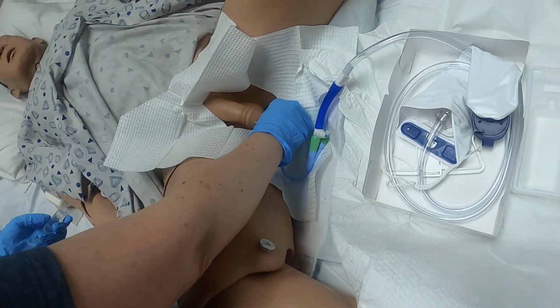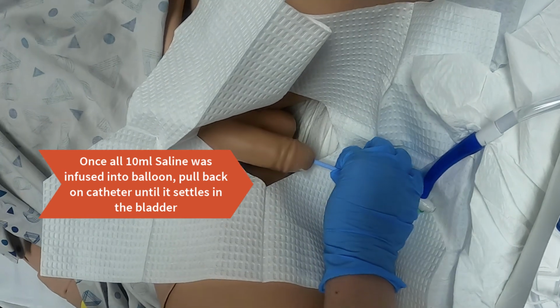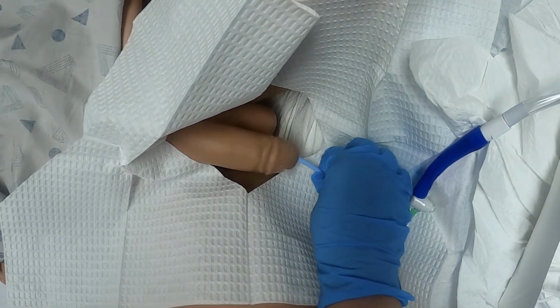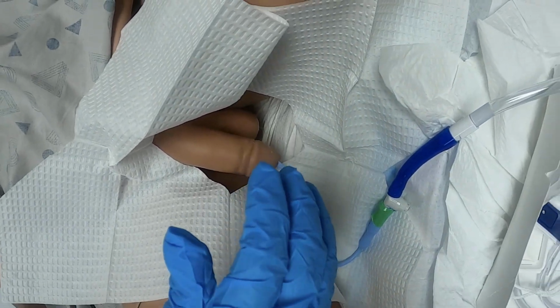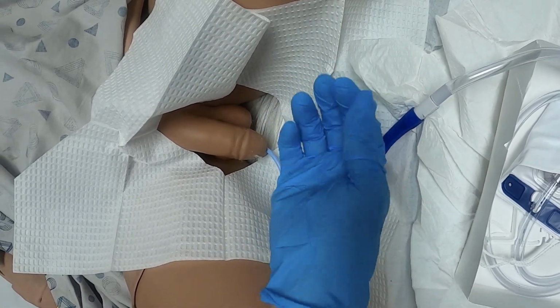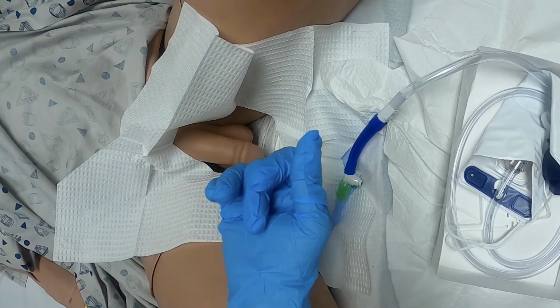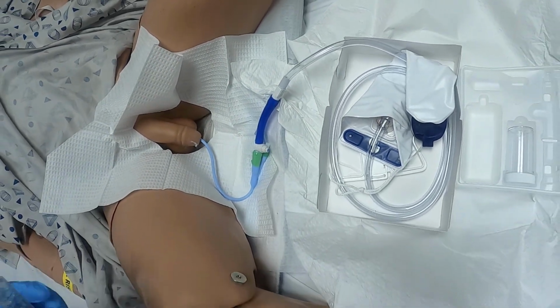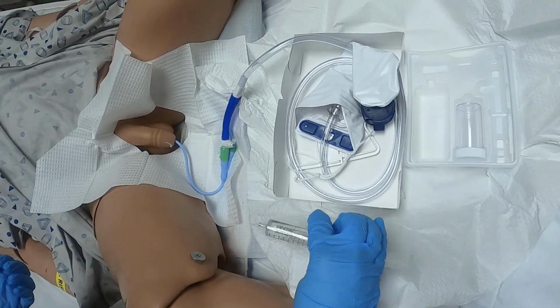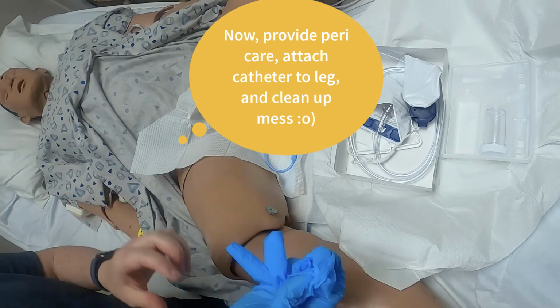Once you've done that, you pull it back until your balloon settles. You want to do that so it is not going to cause any irritation in the bladder. It should always go back to the bladder neck, okay? So afterwards, we're going to take off our sterile gloves, put on new gloves.